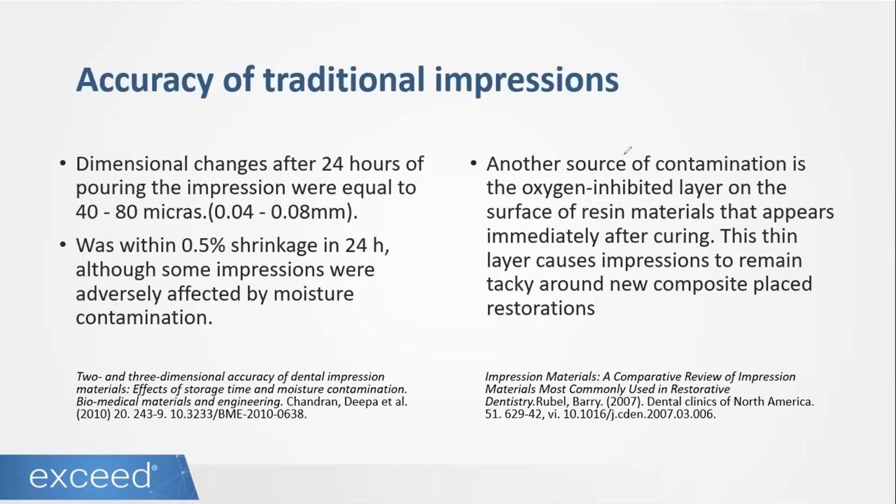If you don't do that, the PVS normally is going to bond to that oxygen inhibited layer, sorry for the pronunciation, it's difficult for me. And you might not see it very well in the PVS impression, but the distortion is there. So that is why you want to light cure on top of glycerin. Then you want to rub it with a little bit of alcohol just to make sure that the PVS is not bonding to that oxygen layer.